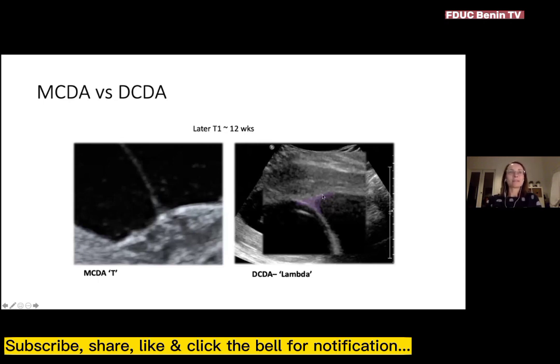And I'm sorry if it seems like I'm labouring this point, but I think it's one of the most important uses of ultrasound in twin pregnancy, because if we don't diagnose the chorionicity correctly, then it's very hard to manage the rest of the pregnancy appropriately.